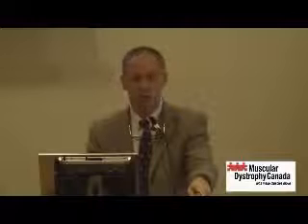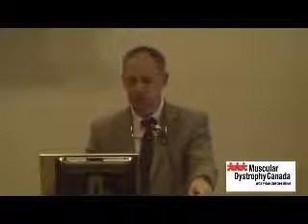And it works extremely well through a cuffed tracheostomy, slightly less well through an uncuffed tracheostomy because you have to rely on glottic closure then. We've also used it through endotracheal tubes with great success. But most often, of course, it's preventive, so we use it through a full face mask.